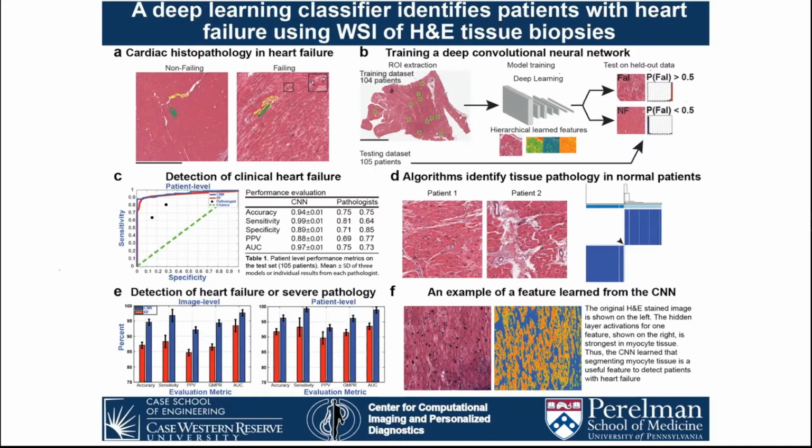Thankfully, like I said at the start, I have the privilege of working with really smart trainees, and they did the digging and found out that the thing that had changed between the second tranche and the third tranche of cases we got was that a remote software upgrade had been applied to the digital slide scanner, and that had changed or perturbed the distributions of these images ever so slightly. And that had really thrown off the network. That's why it went from 97% down to about 75%.